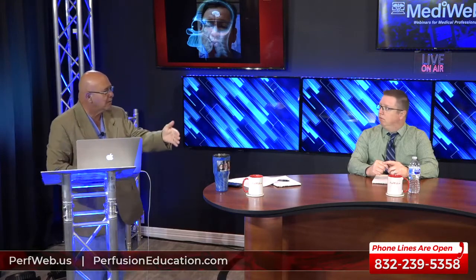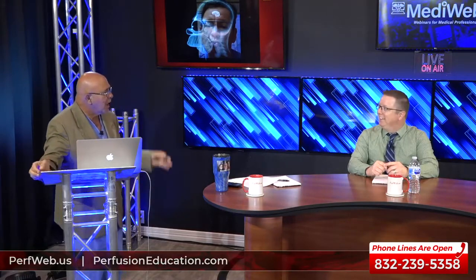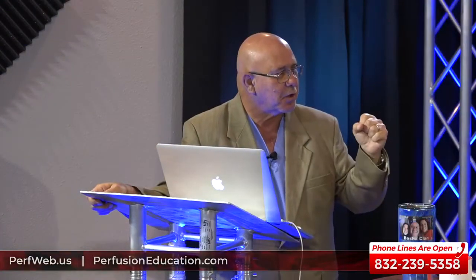Now let me ask you a question. When you're shooting water through a line and you're flowing 5 liters a minute of just saline, pumping it out into the air, and you take a clamp and you clamp across it, you're not having nice linear flow. I know what you're saying. What happens to that pressure at the end of the line, the outflow? How does it behave? You're not having a nice streamlined linear flow, if that's what you're asking. Well, when you clamp it, just acutely clamp it, it just stops. Absolutely. And you feel that pressure drop.